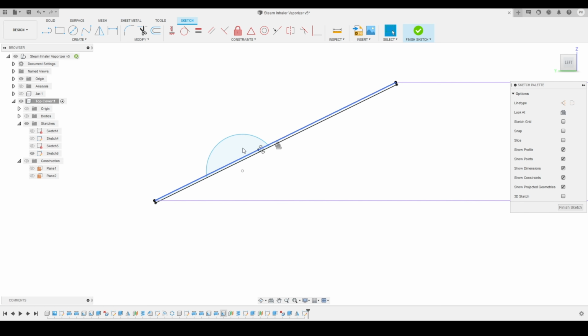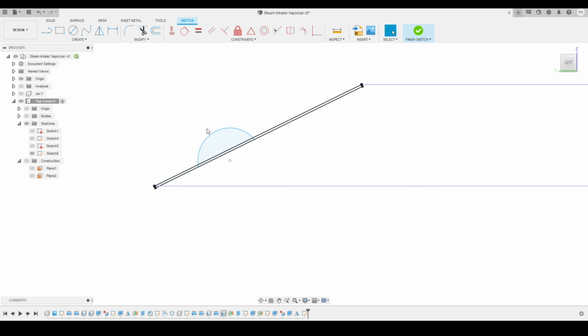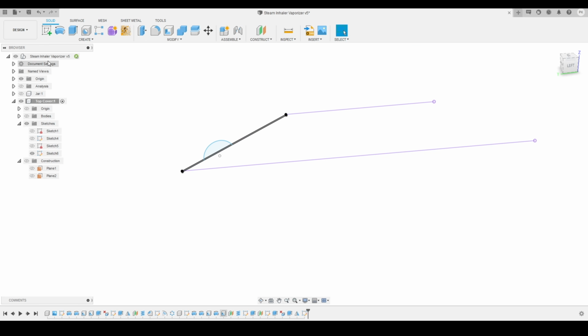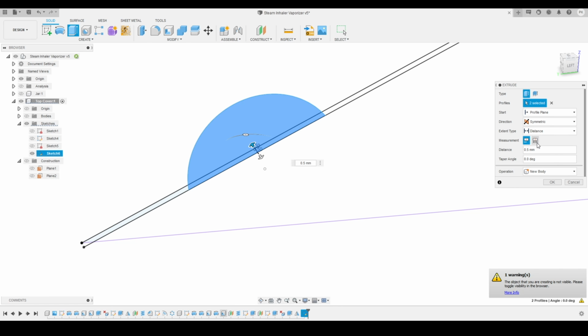So we had created some kind of thing like this using the arc tool. Then I'm going to dimension this arc. This one I just want to keep radius 4.5. Then we'll go on the finish sketch and we'll activate the extrude tool. We'll select these two profiles.